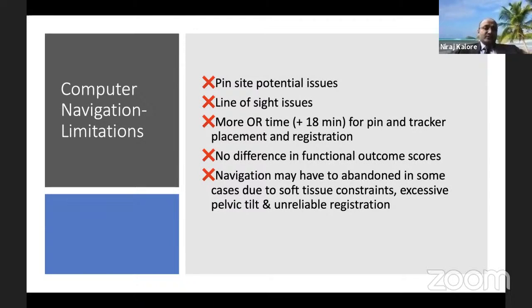This does add more operative time because you are putting the pins, you are doing the bone registration, you are doing the kinematic registration, moving the hip around, finding the center of hip. So all this adds up time to about, in literature, 18 to 20 minutes.